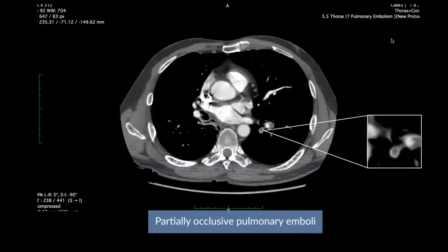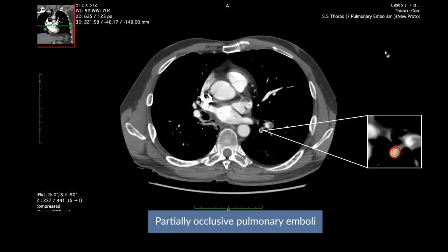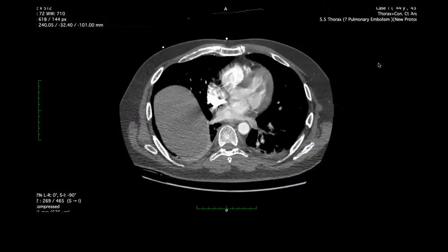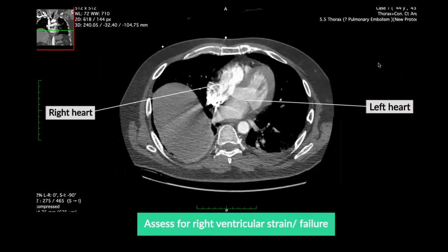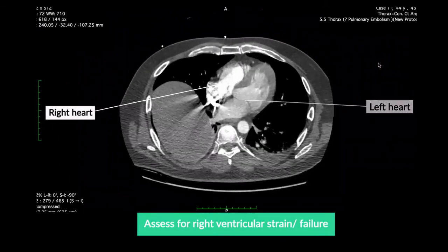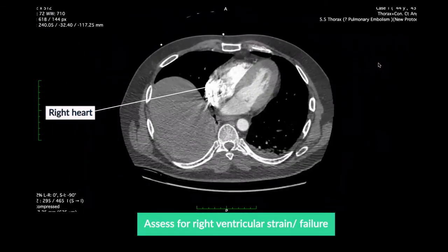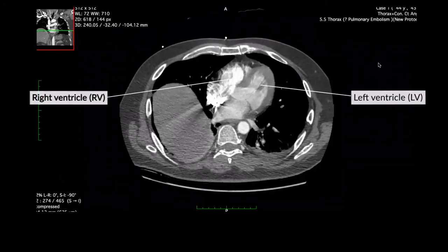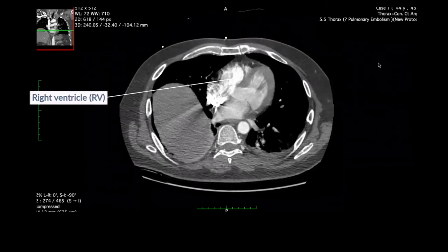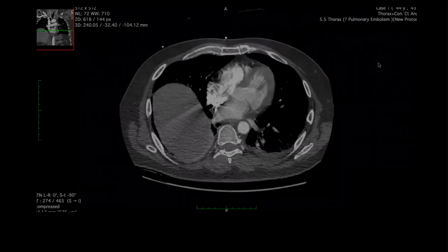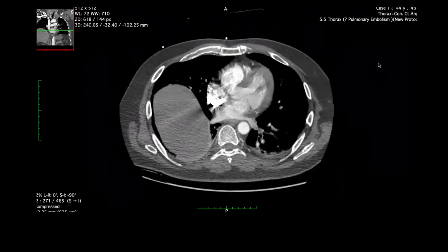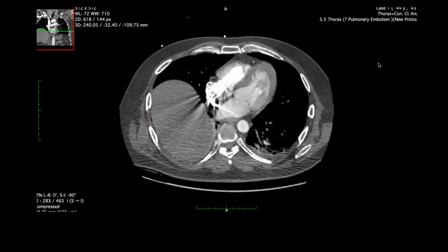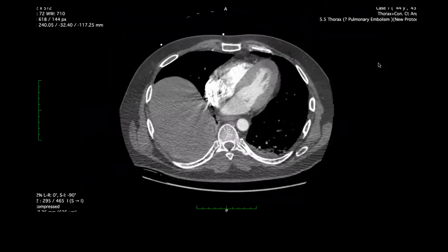This is another case where the polo mint sign is seen very nicely. With large pulmonary emboli the patient may be at risk for circulatory collapse secondary to right heart failure. The early detection of acute right ventricular strain or failure allows appropriate management. Although right ventricular strain or failure is best assessed on an echocardiogram, there are some features that can be seen on a CTPA.